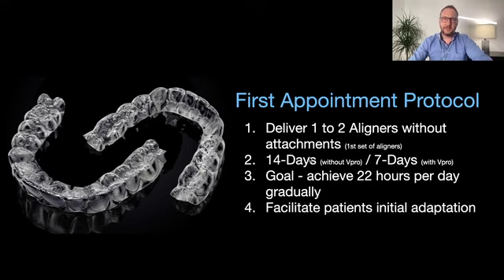And then if the patient has the Vipro, I ask him to change in 7 days and come back to my office in 1 week or in 2 weeks, depending on whether I deliver 1 or 2, okay? If he's not using Vipro, the high frequency vibration, I ask him to change in 14 days, and then he can come back in 2 weeks or in 1 month to my office, okay?